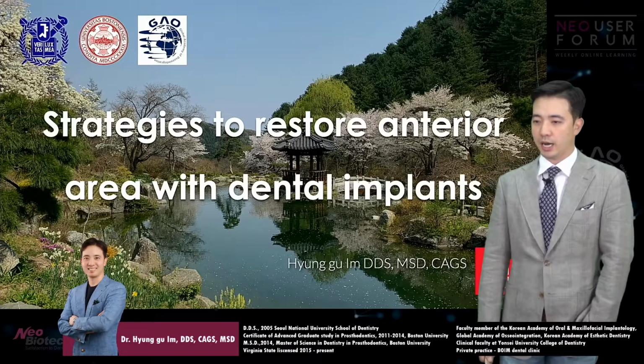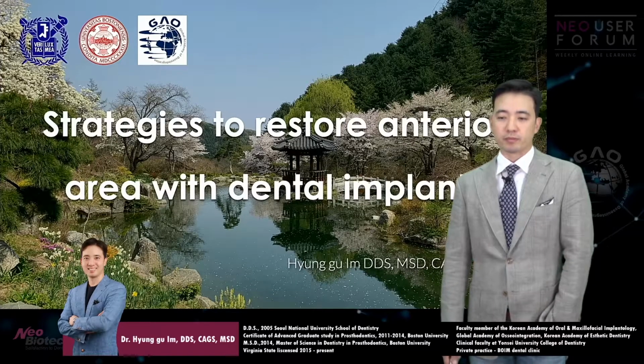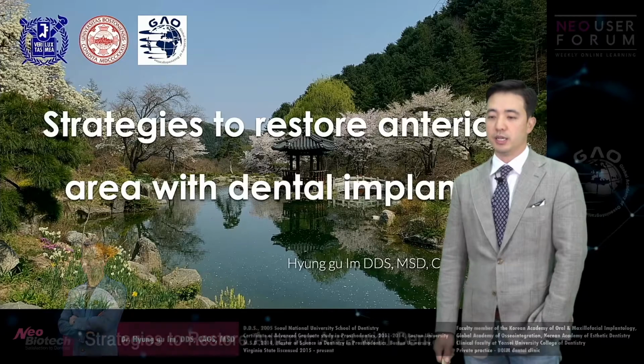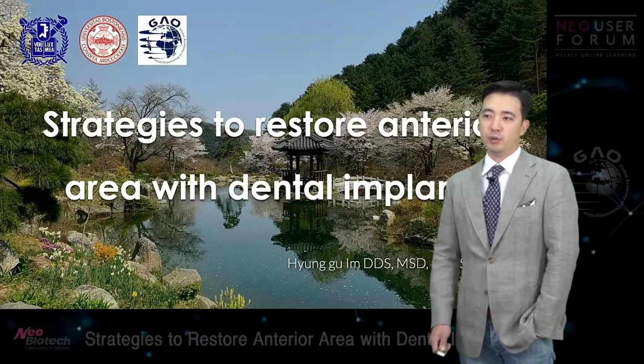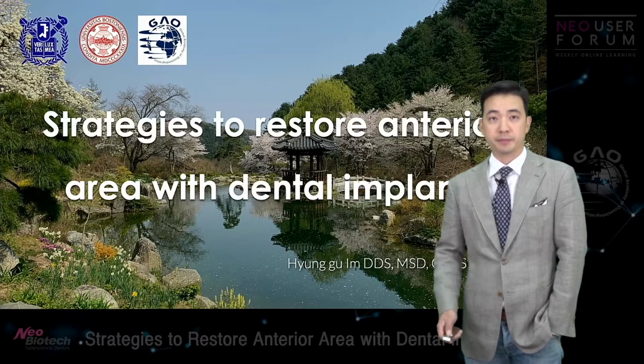So today I'm going to talk about some of the strategies to restore the anterior area with dental implants when we have a bit of a challenging clinical condition.